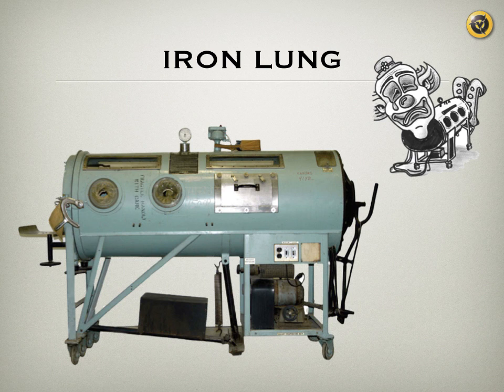So the iron lung was very successful in the 40s and 50s, when there was a polio epidemic. Polio patients had normal lung compliance, but they had very strong weakness, and the weakness would not allow them to breathe. So you put them in those tubes, or iron lungs, for a week or two, and the weakness of the respiratory muscles gets better, and hence they improve when you take them out.